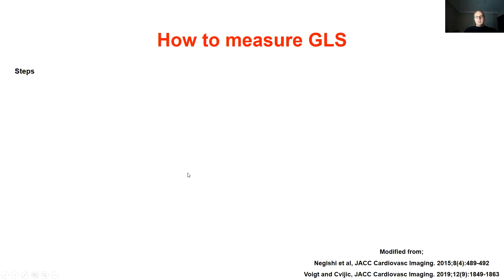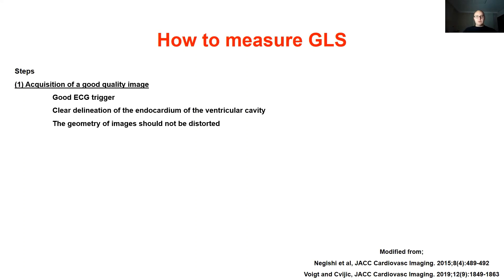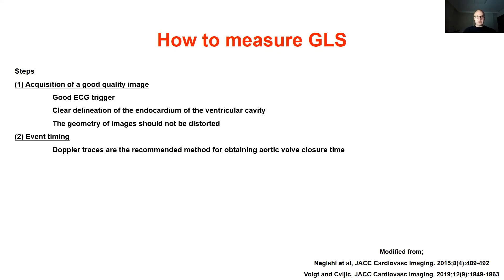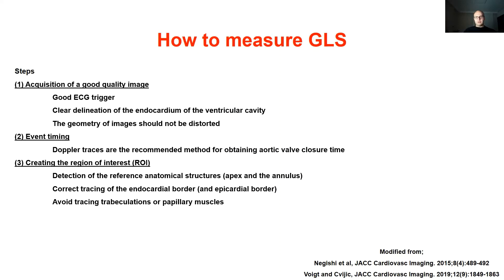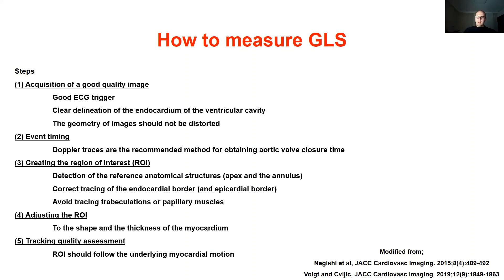To measure strain or GLS, there are several steps. First, a good quality image must be acquired, focused on the left ventricle with good ECG triggering. Endocardial borders should be visible during systole and diastole. Second, set up event timing — the best way is to use Doppler traces to define exactly aortic valve closure time. Then the region of interest can be created: reference structures should be focused on, endocardial and epicardial borders should not be exceeded, trabeculations and papillary muscles should not be traced, and the region of interest should be checked for tracking quality.